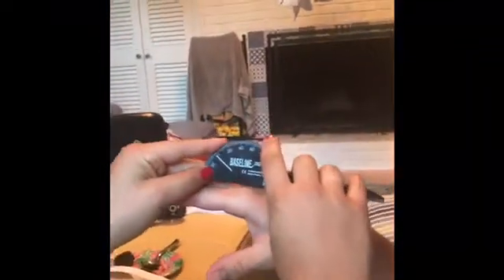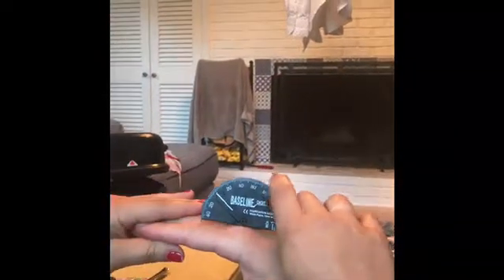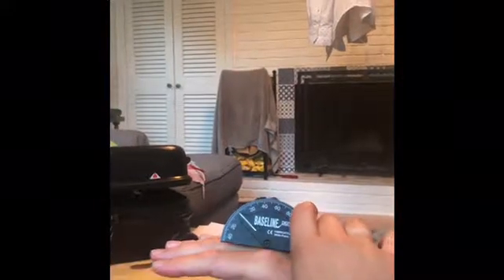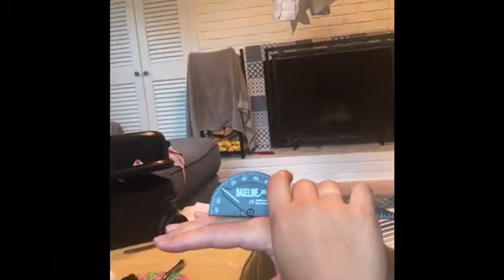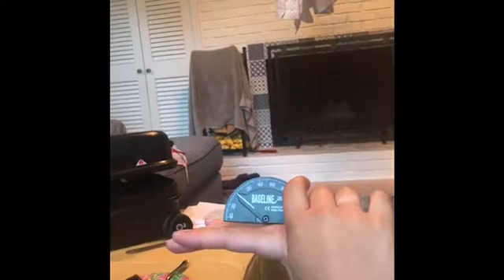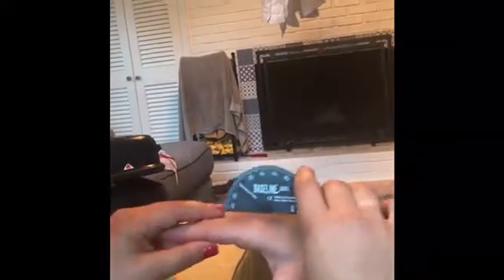We're going to be measuring MCP flexion. The typical range of motion is 0 to 90 degrees. The axis is going to be the dorsal surface of the MCP joint of the finger. The stable arm is going to be midline of the dorsal surface of the finger metacarpal, and the moving arm is going to be midline of the dorsal surface of the proximal phalanx of the finger. So go ahead and flex right there, put it into a fist. Go.